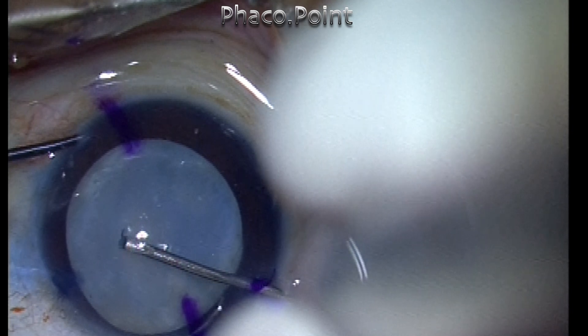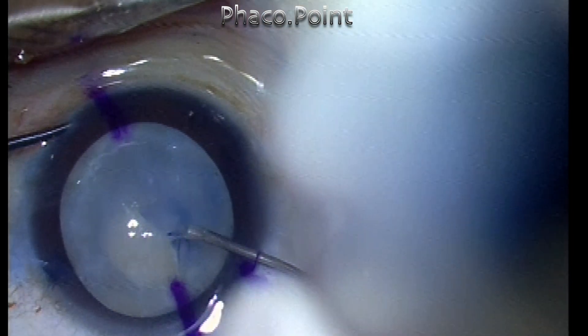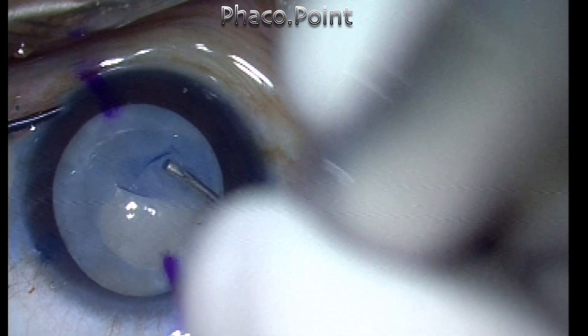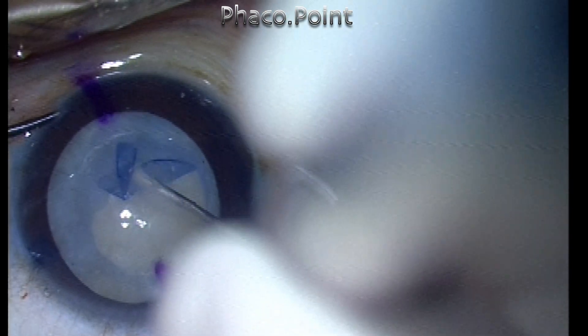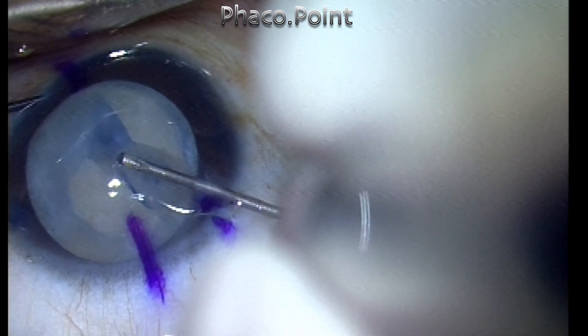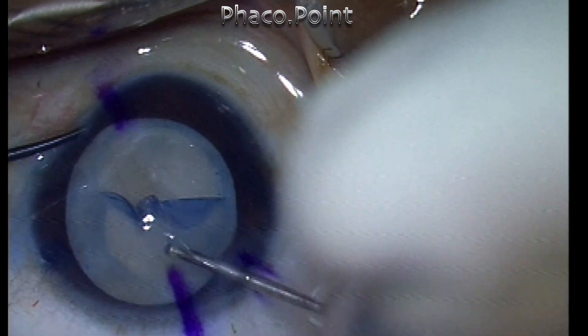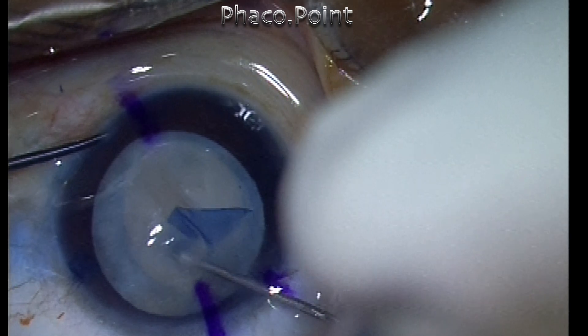This elderly lady was being operated upon under topical anesthesia. She kept moving her eyes and her head about during the surgery. So I'm carefully performing the capsulorexis with the help of a cystitome. However, there is going to be a little problem in doing so because there is no support for the capsule against which you can tear it easily. In this case, I have managed to get a 5mm capsulorexis.